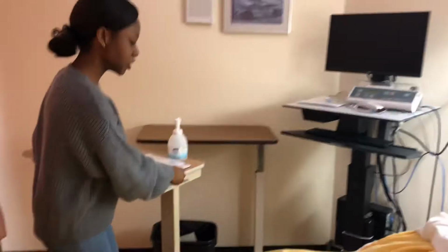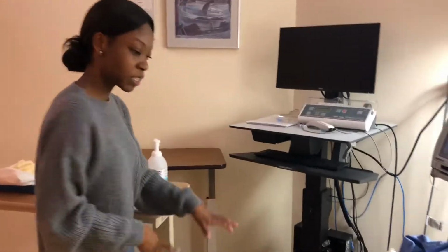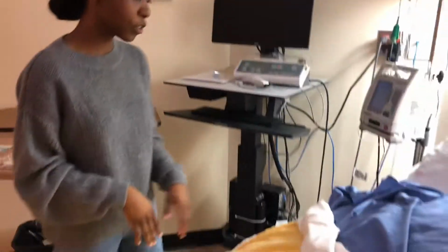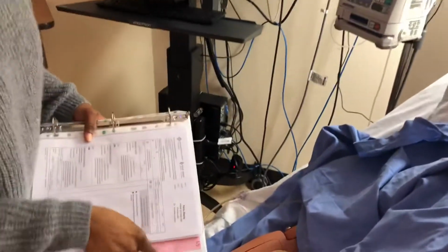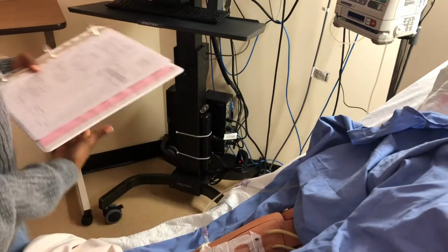Name is Toby. I'll be your student nurse administering your medication. So I'm just doing my safety check, making sure there's nothing on the floor. And can you tell me your name? Paris Maris, okay? And your date of birth? Okay, thank you very much.